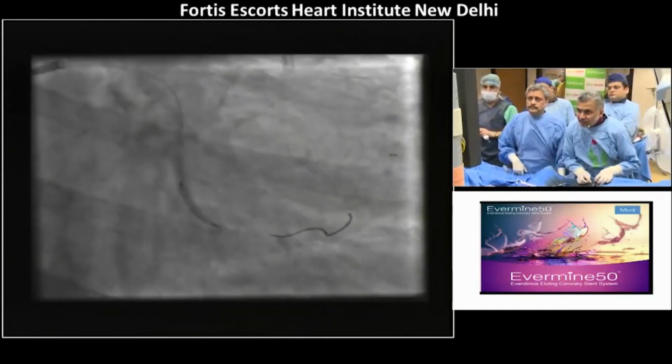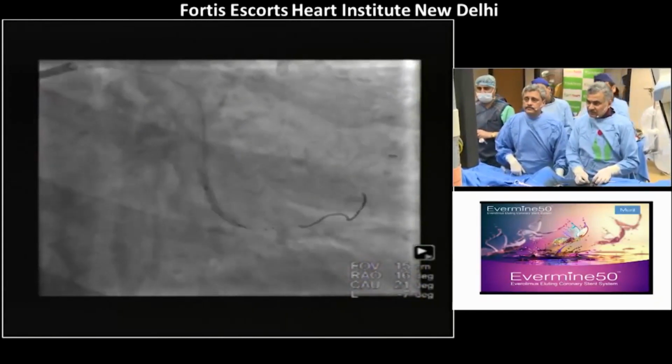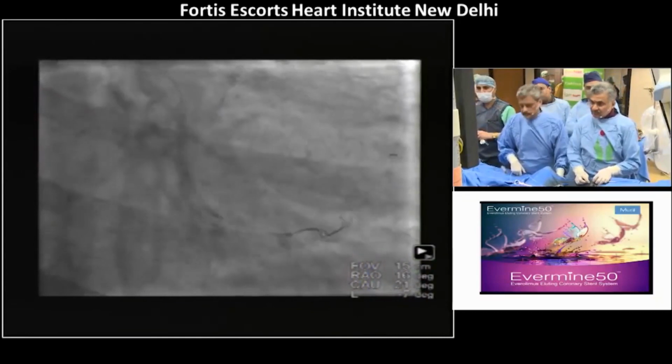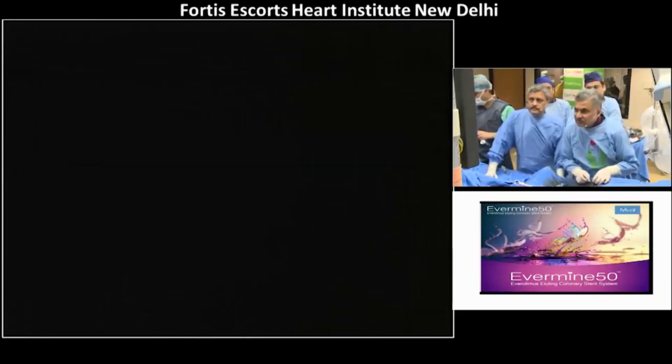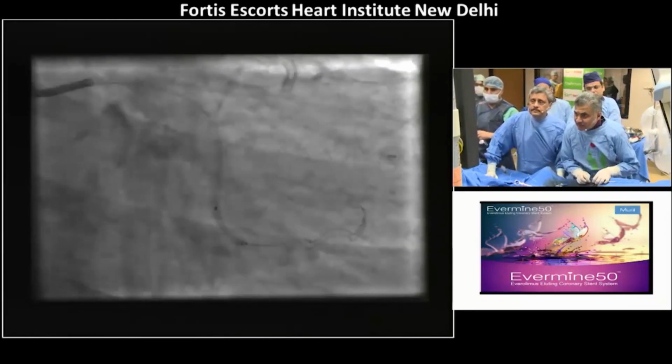Typically what I do is I go to nominal, deflate, come down, go up again, come down, then I can bring the balloon back, pull back a millimeter and then go high. This is what we are exactly following.